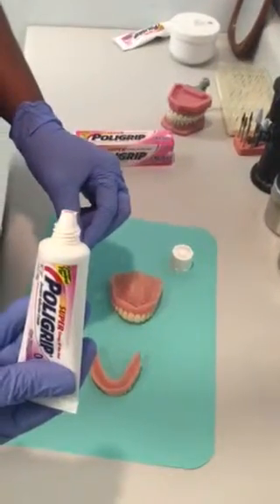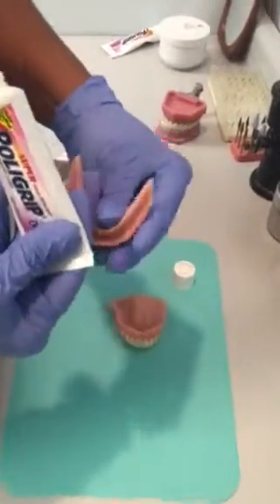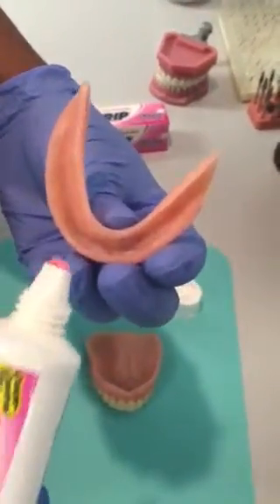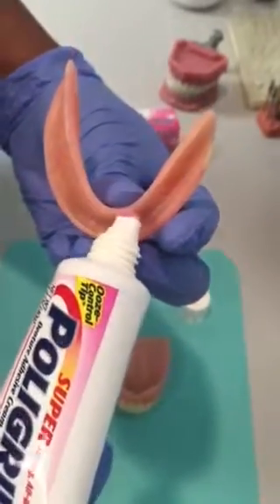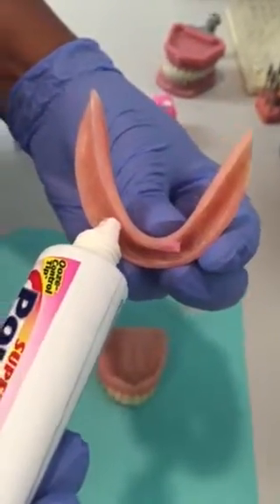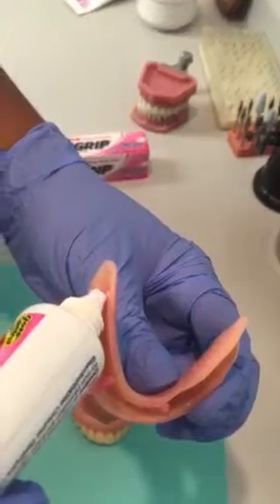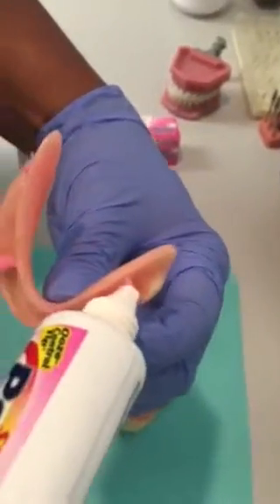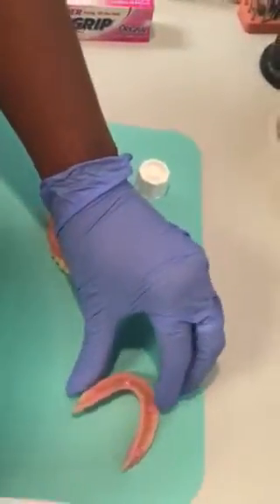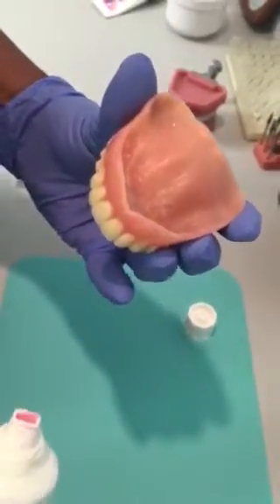You squeeze just a tiny little bit. Place a tiny pea-sized drop in the area of the eye teeth — just a little drop — and at the back near the molar area. That's for the lower denture.